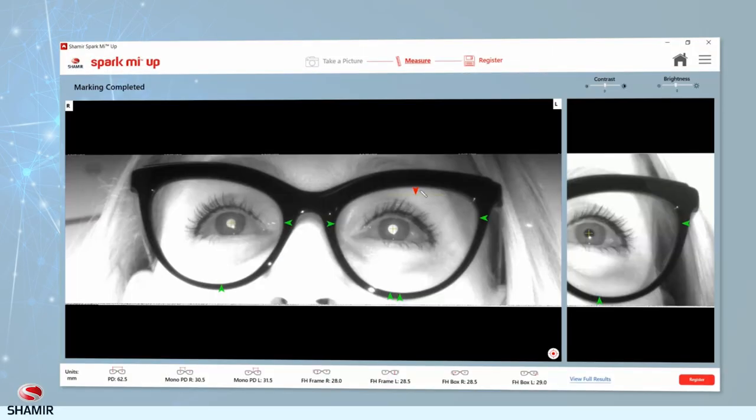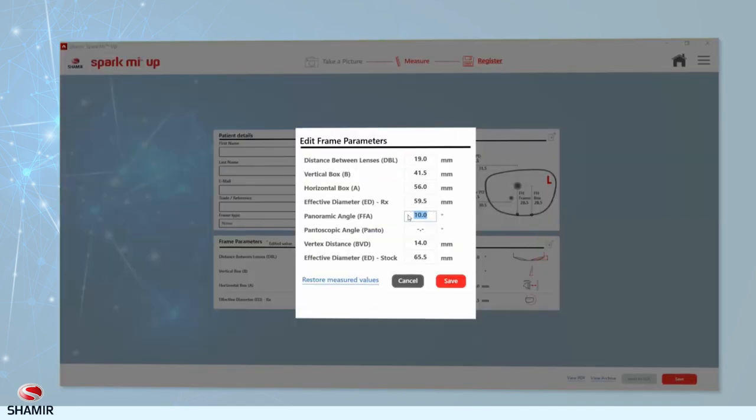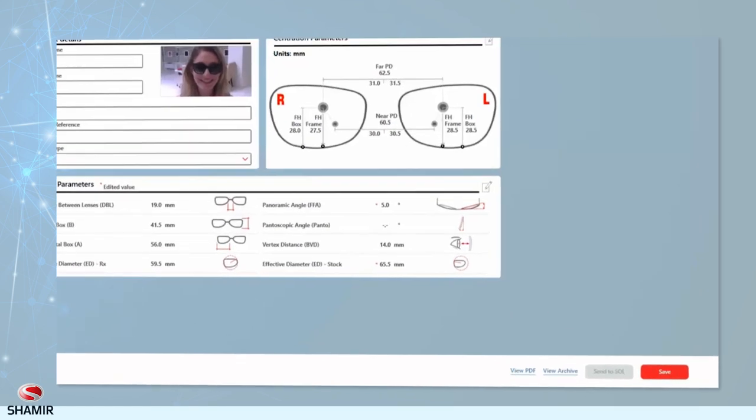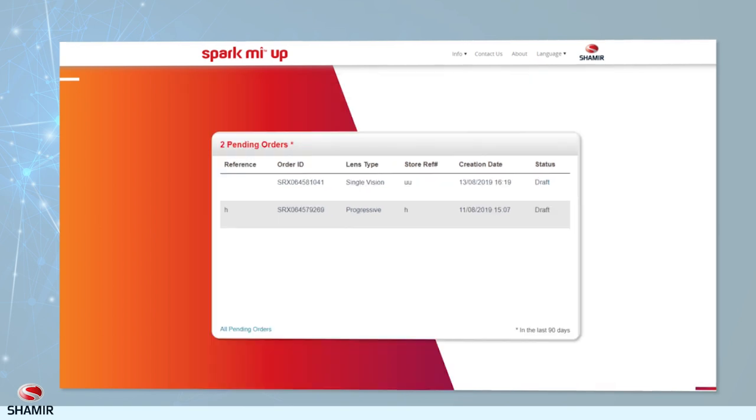If you notice a measurement that doesn't seem right, this could be due to a failure to mark a point on the image measurement screen. Simply go back to the measurement screen and adjust the points. There's also an option to edit results manually via the Register screen. If you have a Shamir Online account, you can send a job directly to Shamir by clicking the Send to SOL button. Once the job is successfully sent, it will appear in Shamir Online under the Draft section. Choose Edit to proceed with the ordering process.